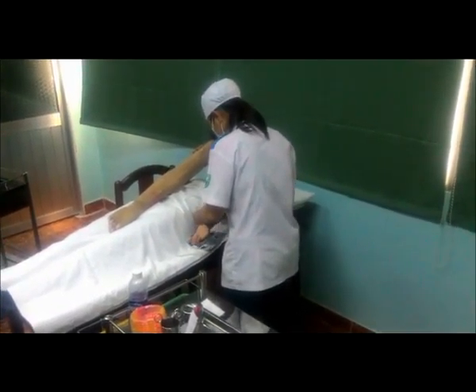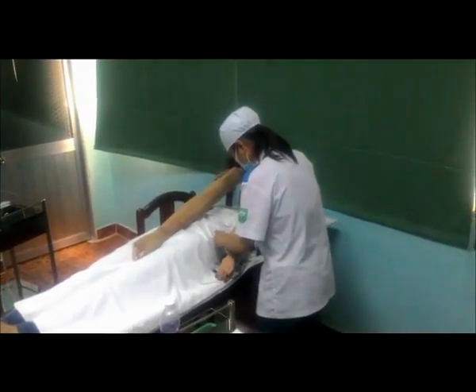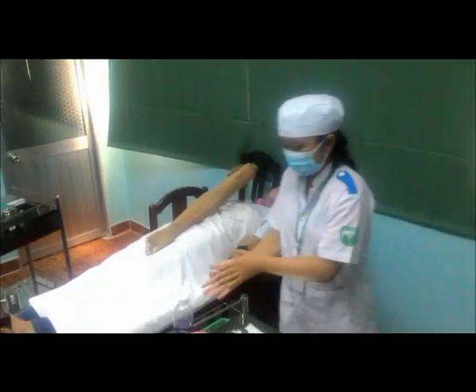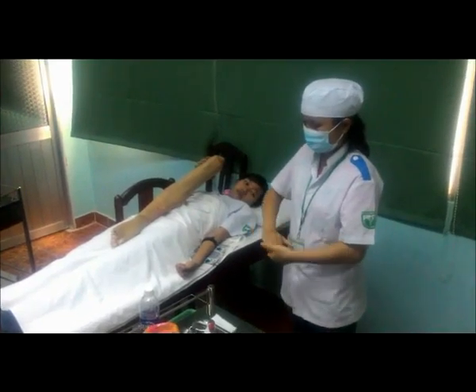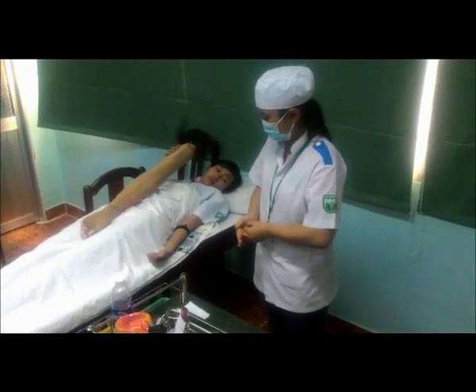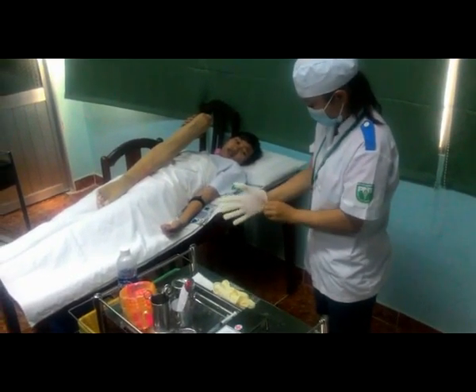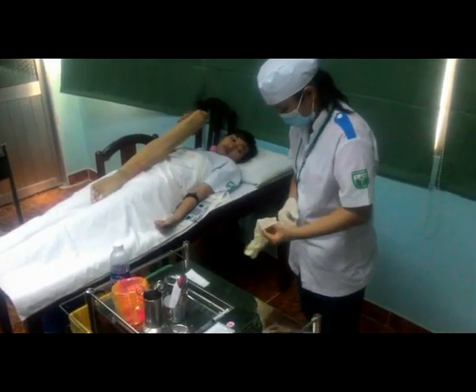Rửa tay lại bằng dung dịch sát khuẩn tay nhanh, mang găng tay. Sau đó thắt dây ga-rô cách vị trí tiêm 7-10cm. Cho bệnh nhân nắm tay lại chặt.